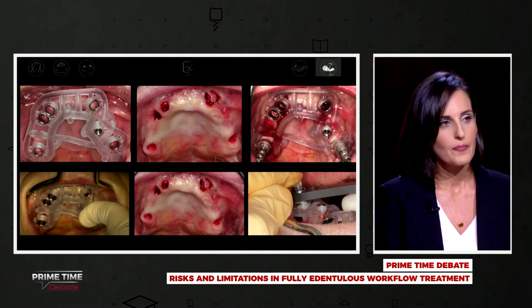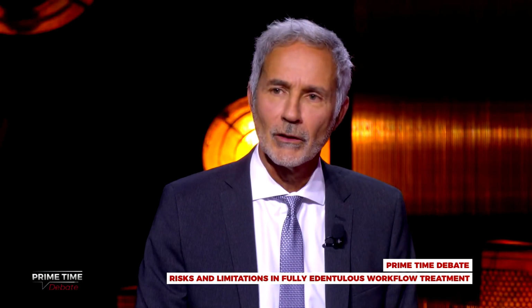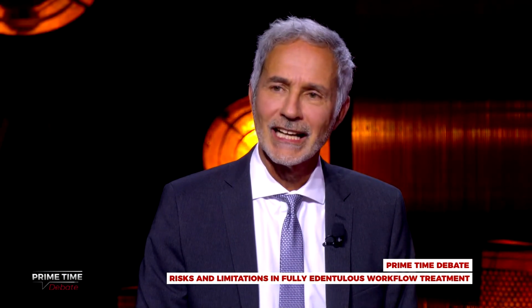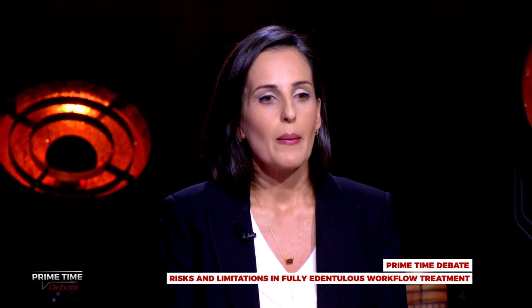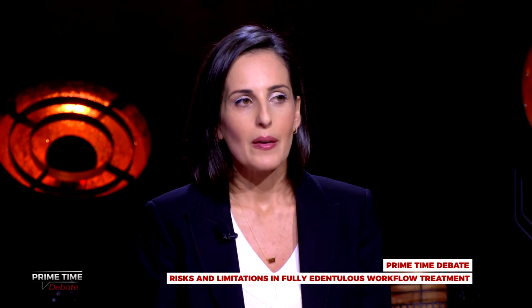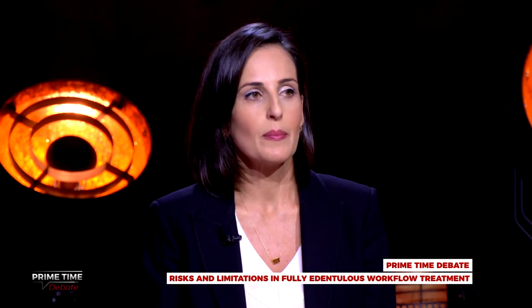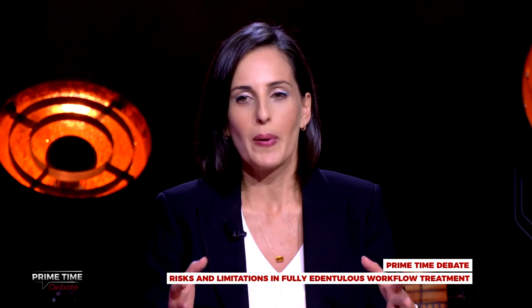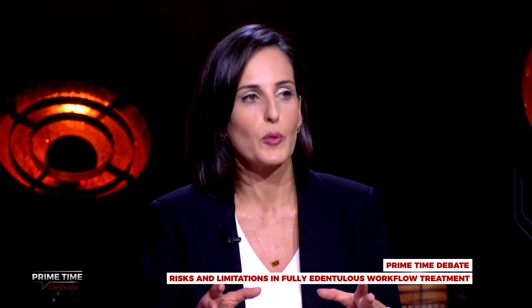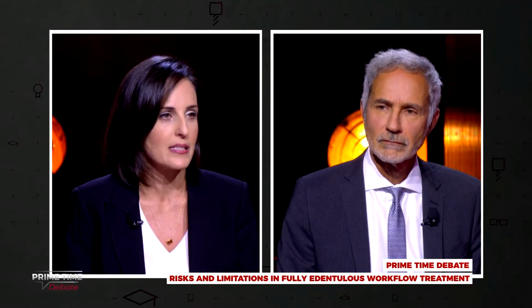And Tali, sorry, what do you think about the use of fixation pins in order to augment the stability of the guide? Thank you, Sergio. That's a very important question. Many times colleagues take fixation pins as a means for calibration of the guide. It means that if we plan fixation pins and now we just put the guide in place, we can be sure that the guide is sitting properly.